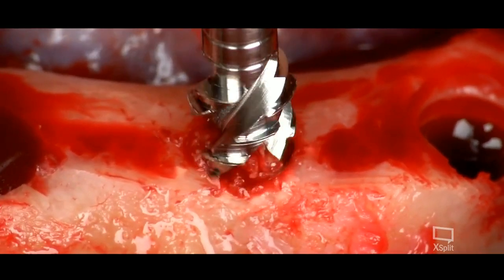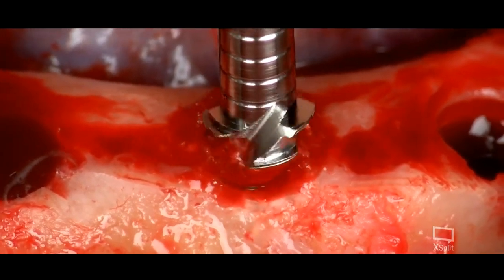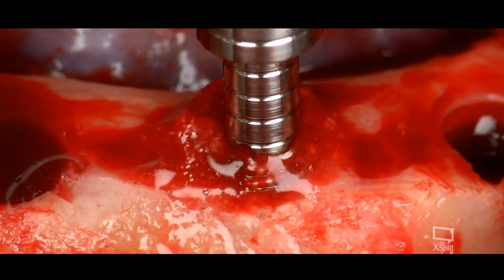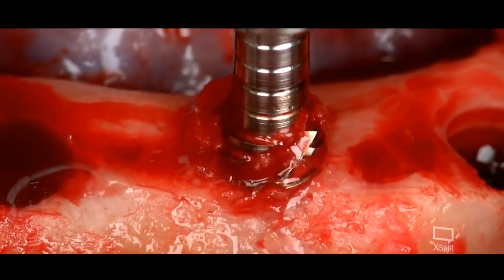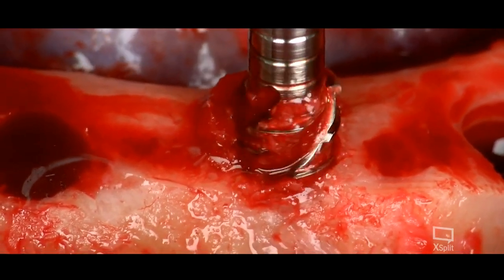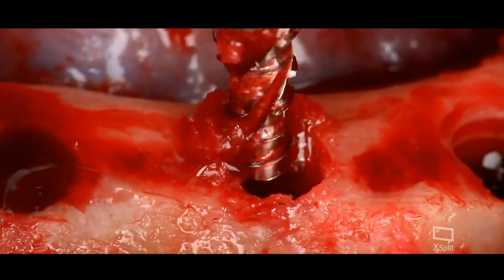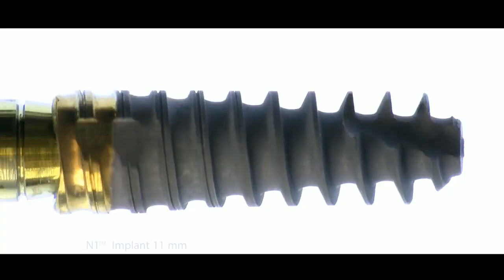Of course, here the double milling function was not used, just the normal way, and the doctor glued the provisional basis for immediate loading directly on the day of the surgery.